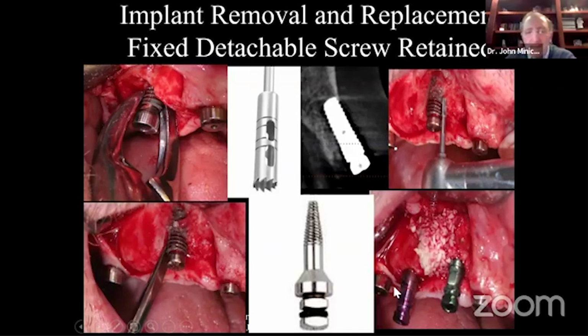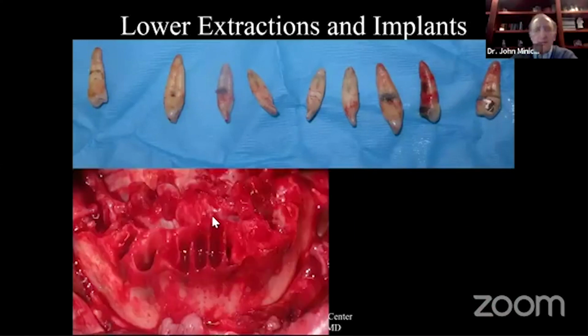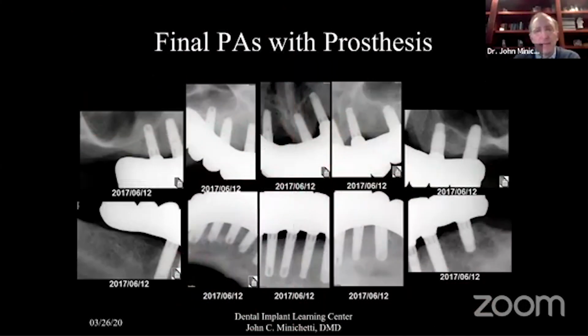And then for Anthony, we placed a couple of implants adjacent to these failing implants on the upper left, and another one anterior to that failing one on the upper right. Moved down to the bottom while the uppers are healing. He was in a removable upper denture, and on the bottom, we placed some immediate implants on the lower, and finally restored him to a fixed or detachable upper and lower zirconium milled prosthesis.